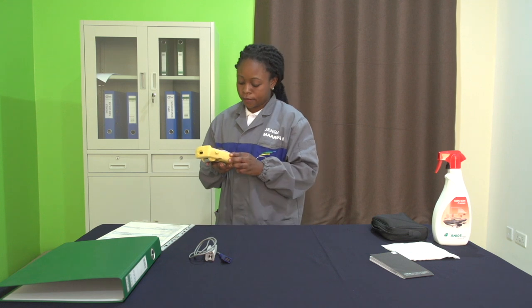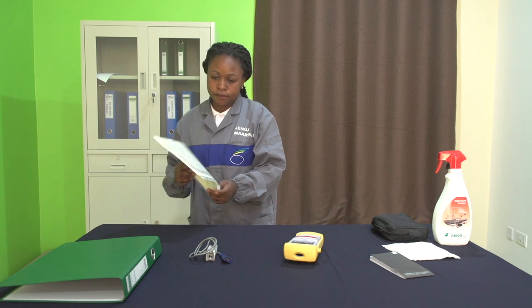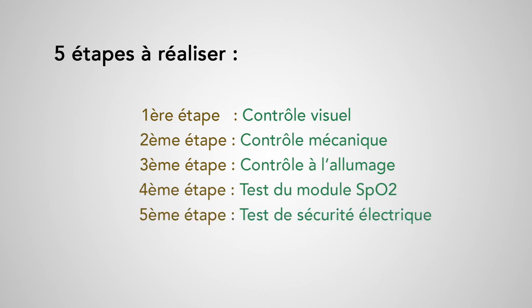Pour réaliser la maintenance préventive de cet appareil médical, il faut consulter en priorité la documentation technique de la marque et du modèle de l'appareil. L'appareil que nous avons ici est un oxymètre de pouls portable. Dans la procédure que nous vous proposons, il y a cinq étapes à suivre.